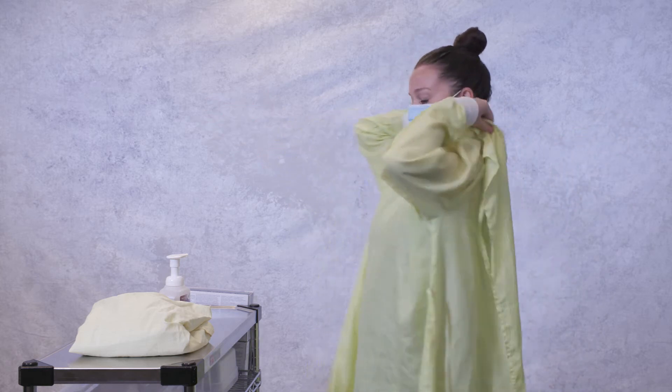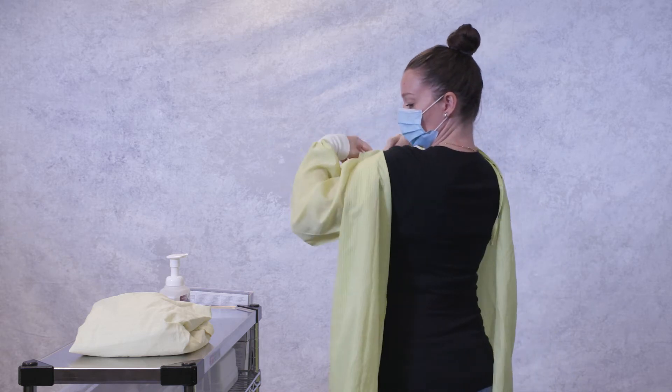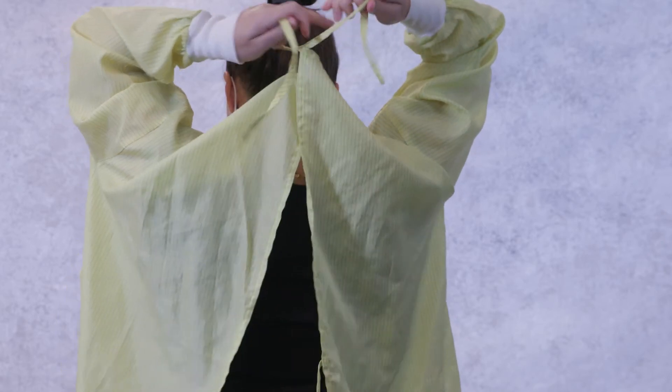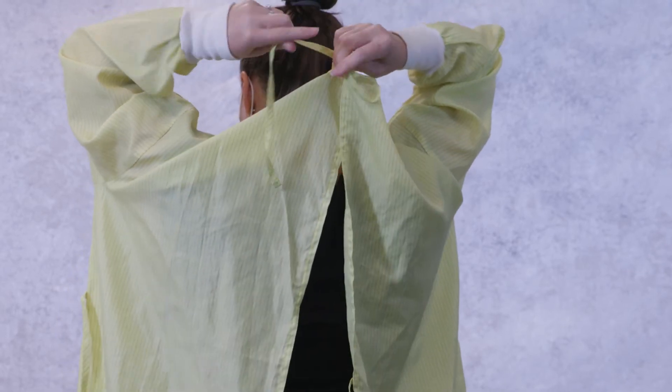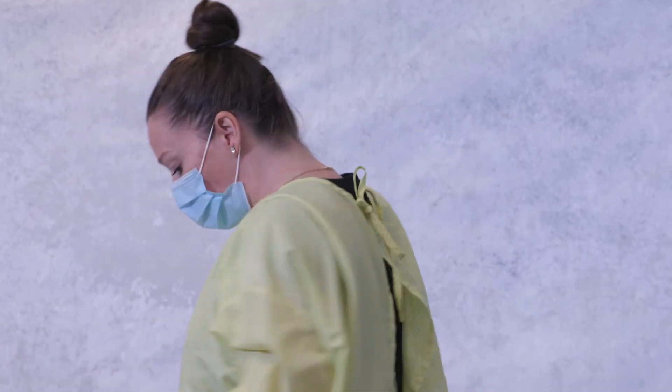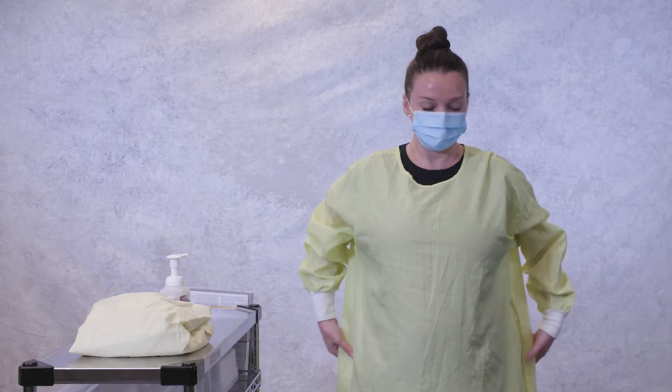Tie the ties behind your neck. Straighten out the gown, making sure your clothes are fully covered, and tie the ties at your waist.